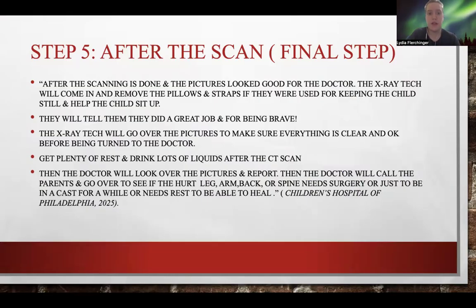Then the final step. After scanning is all done, and if the pictures are looking good and the X-ray tech does not need to do them again, then they will come in, they'll help you up, remove the pillows and straps if they were needed, and help you sit up. Then they're going to give you some liquids and some food to eat. And they're going to tell you you did such a good job for being brave. So getting lots of rest and eating plenty of food and liquids after the CT scan is done.